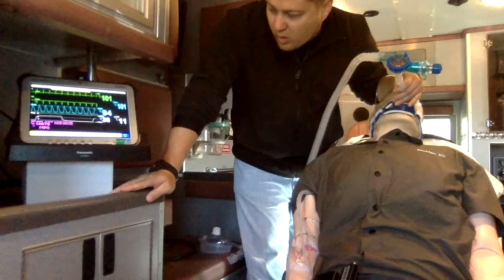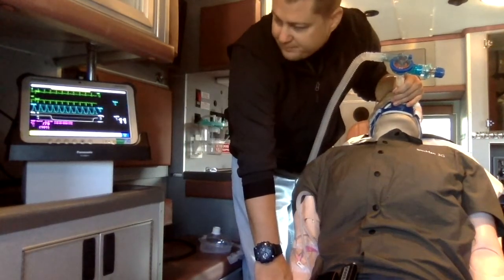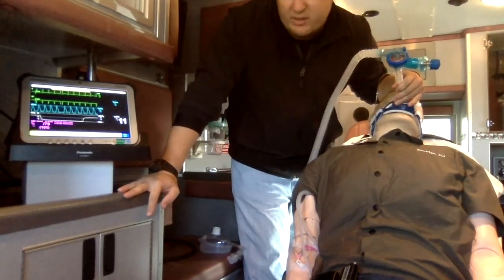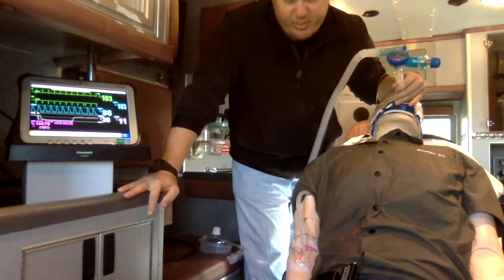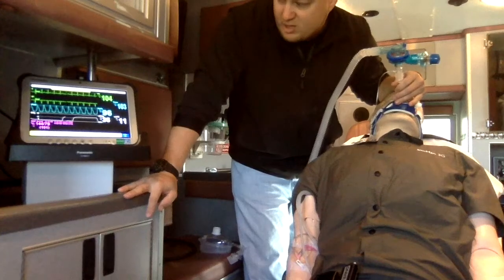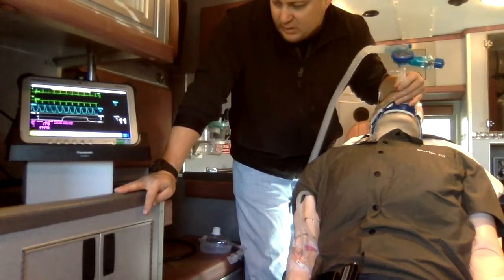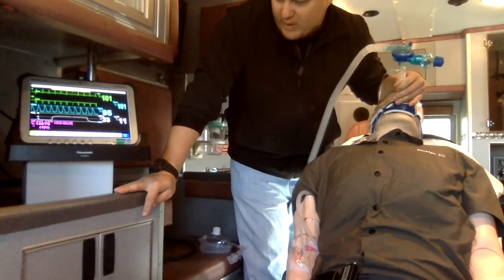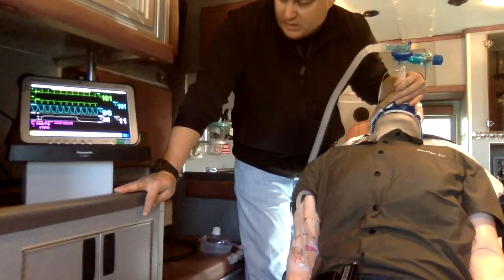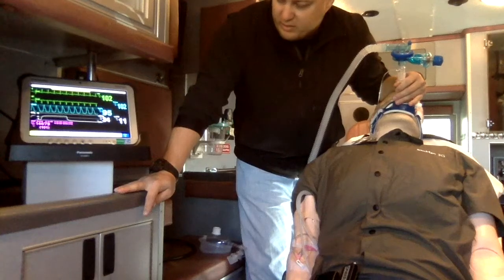Heart rate's down to 101. Strong and regular rate. SpO2 is still 96%, had no decrease or no desaturation during the intubation process due to the pre-oxygenation phase and the PEEP adjustment that we did prior to intubation. Blood pressure is now 144/79. End tidal is 35 with a square waveform, so I have good inspiratory and expiratory waveform. Looks like the tube is secured in place.